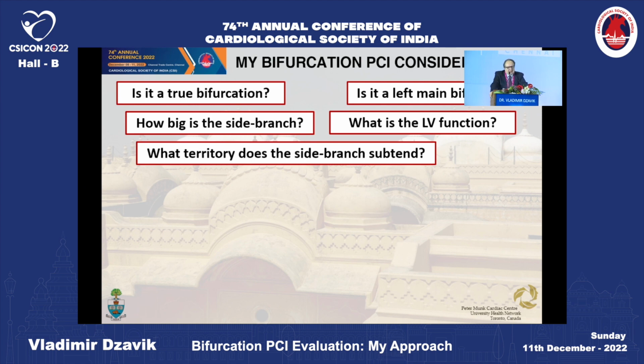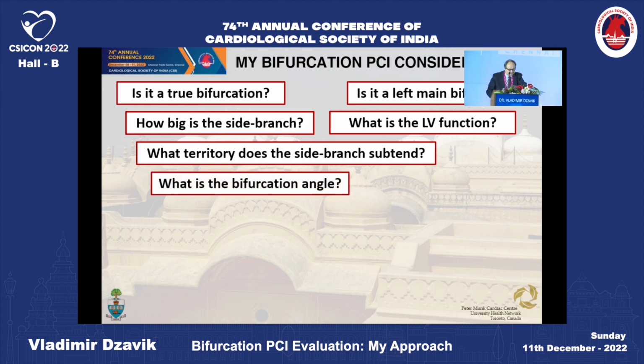If your LV EDP, if your right heart pressures are very high, I may at some point, in a patient who's not unstable at that point, refrain and delay the procedure until the patient is better hemodynamically optimized. So those are important considerations. And monitoring with a PA catheter during the procedure, which is often long and complex, is also important.